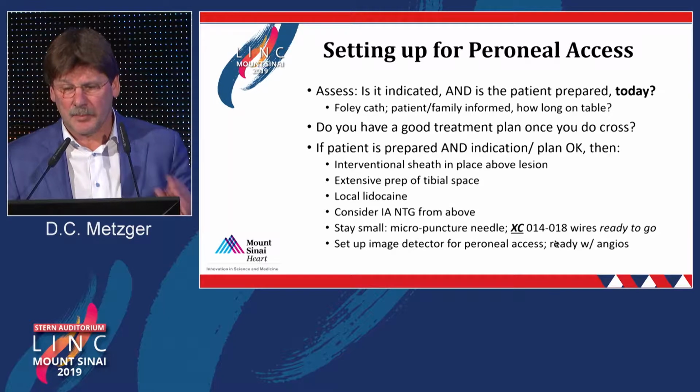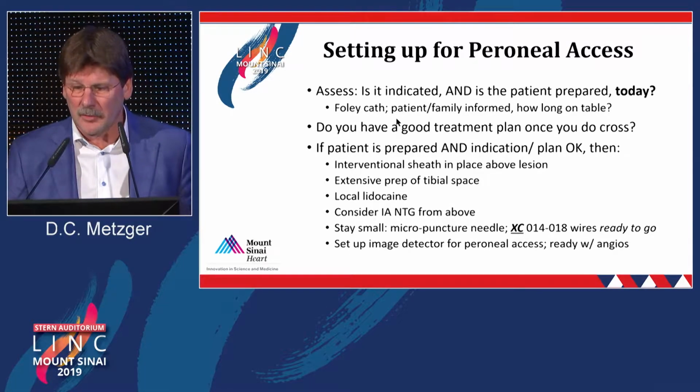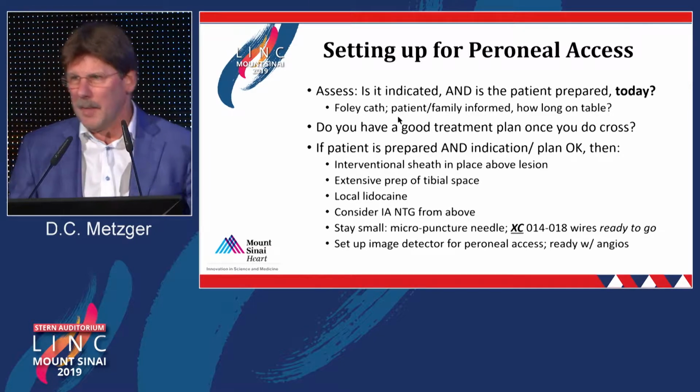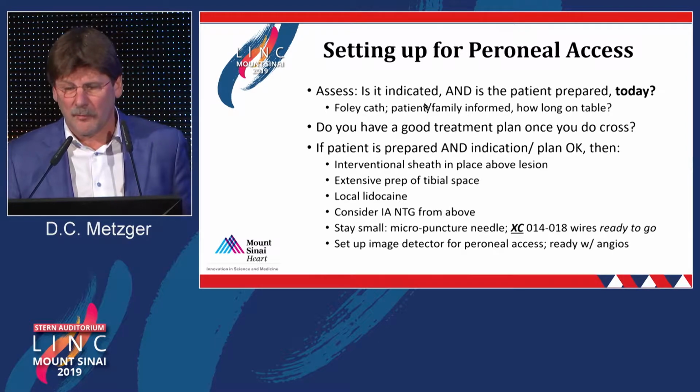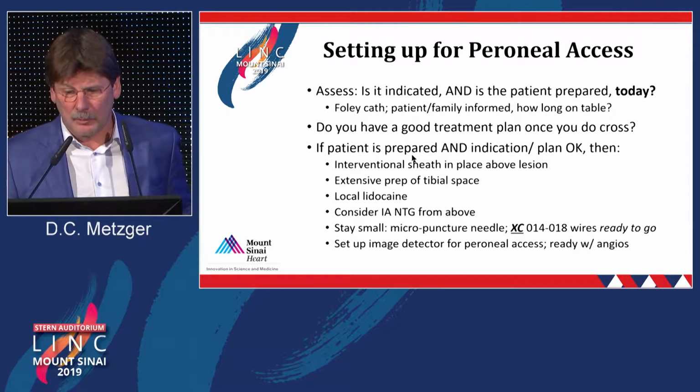So, setting up for peroneal access, first, I think it's important to ask yourself, is it indicated? In other words, if the patient's been on a table for 2 hours without a Foley, maybe you don't want to do it then. But otherwise, if they're informed and ready and you have a good treatment plan, then we go ahead and proceed.